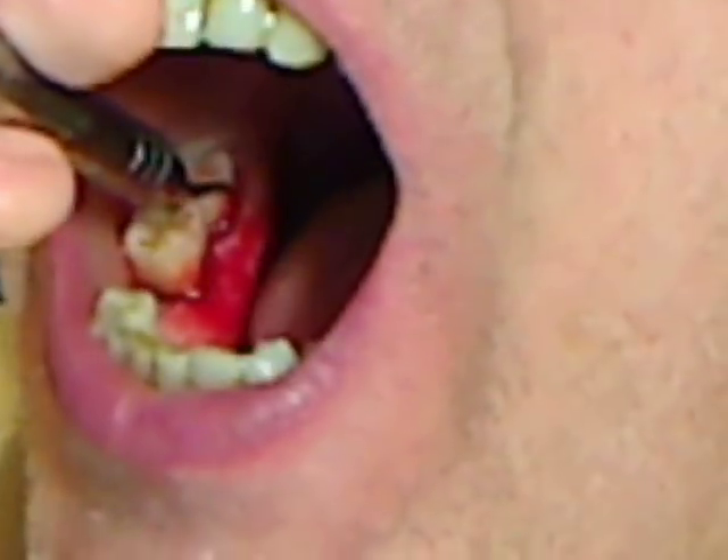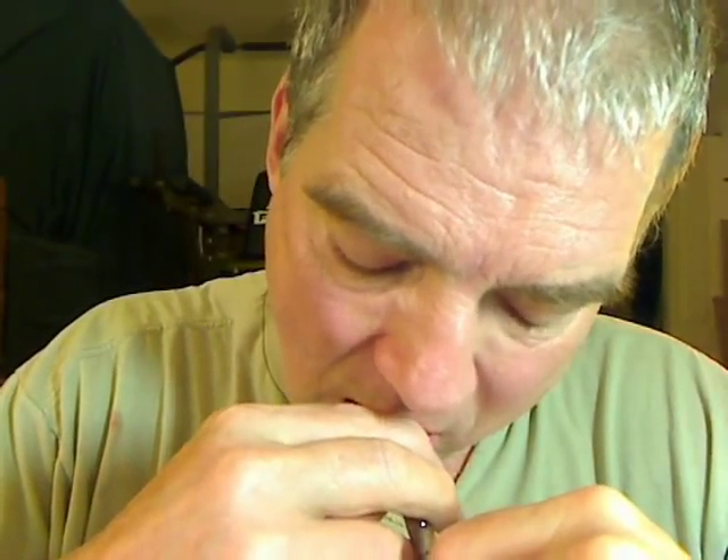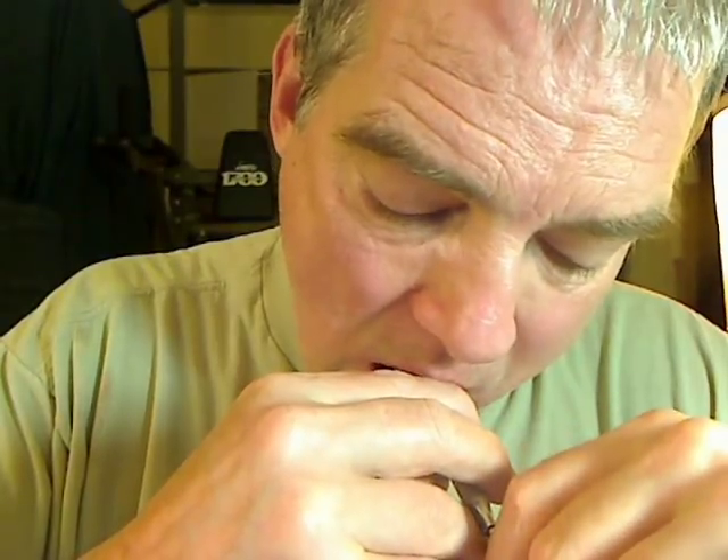I sort of went into a deep area — let's find out where it is. This is presumably where the abscess actually is right here. I got in deep; I'm somewhere — it's a little confusing where I am. There we go. Looks like this is it — this is the abscess right here. I don't want to screw up. There it is. I put the curette in and then it just slipped right into a deeper area. I don't know exactly where the deeper area is, but it's starting to bleed. Do I need to figure out why it's bleeding or exactly where? I would argue that it's not necessary.